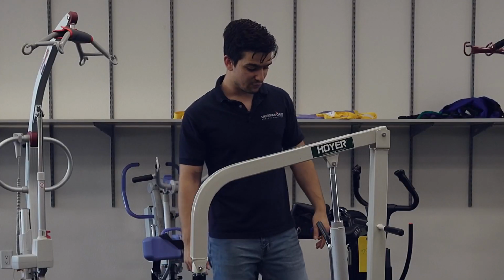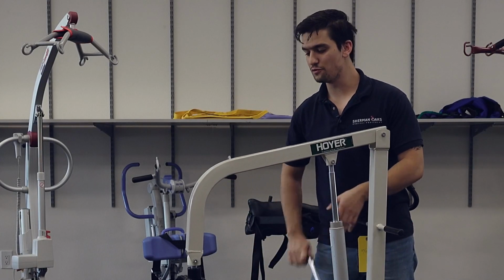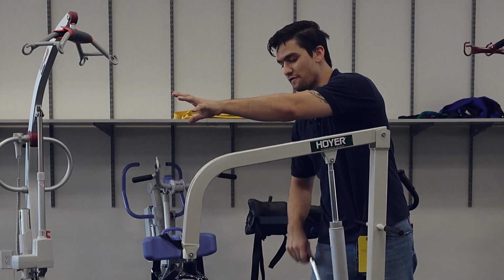The biggest downside to a manual lift is that the raise and lower are all over here, while the user is going to be at the end over there. A manual lift needs less maintenance because there's no batteries to charge, but takes more effort to use.